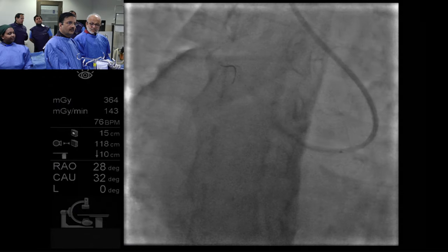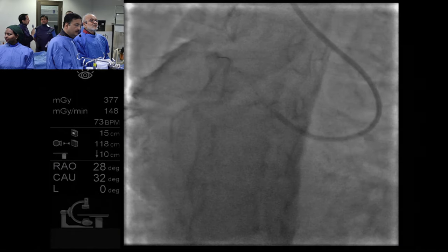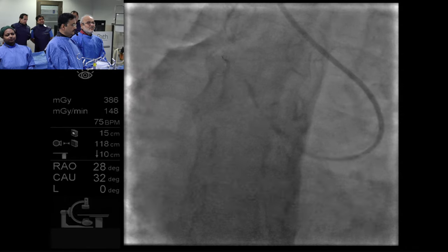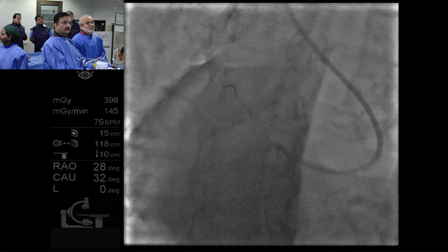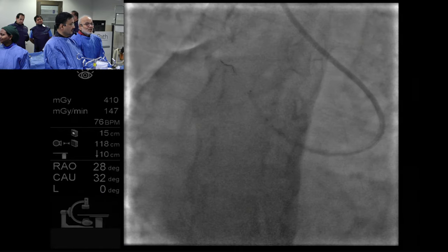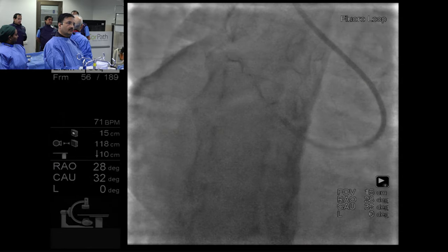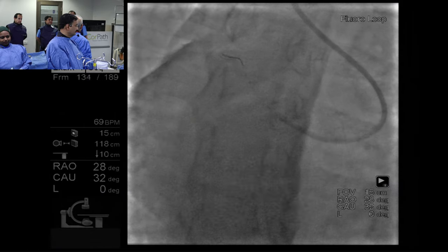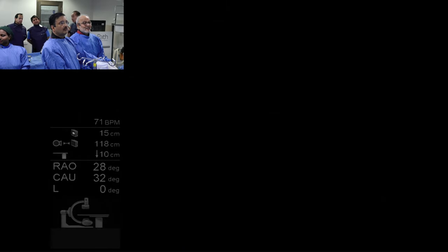Get the OCT ready. What are your imaging criteria for rotor? What's your IVUS imaging criteria? It went in well. I think at least 270 degrees of calcium. If there's a long lesion, I really prefer rotor over lithotripsy. The new IVL balloon, you can get 120, 160. I think we are going to show that in one case. For the long lesion, it's definitely helpful.